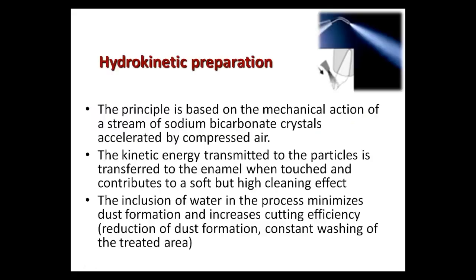And the last type of alternative preparation is the hydrokinetic way. The principle of hydrokinetic preparation is based on the mechanical action of a stream of sodium bicarbonate crystals accelerated by compressed air.